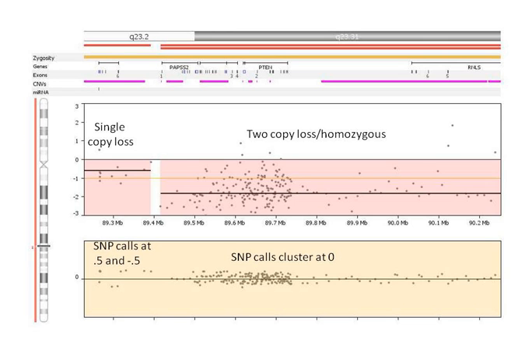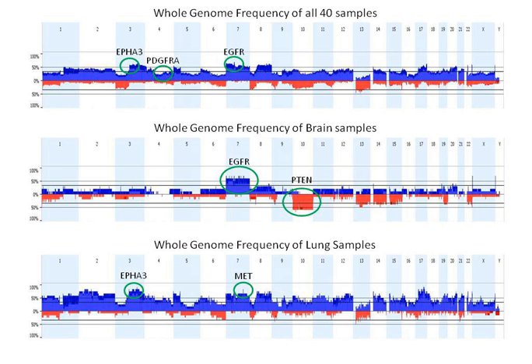And so I just show you how the 2-copy loss looks like in this case. So you have single copy loss clearly visible, and a 2-copy loss here, which is indicative of homozygous deletion in this PTEN gene. So this is just a beginning. We are beginning to analyze more data and going back on the NGS.